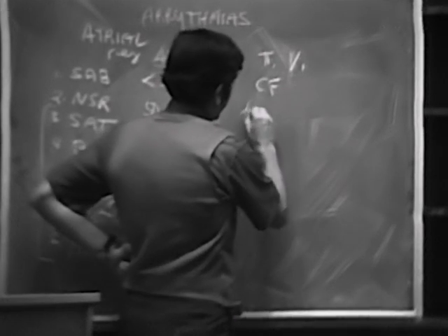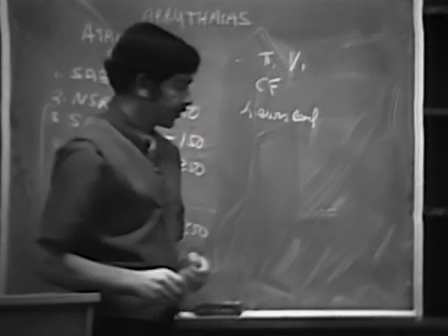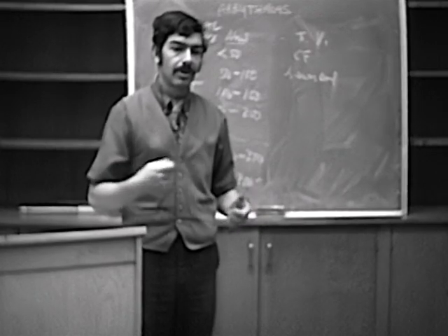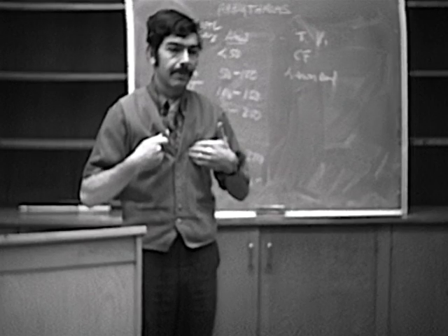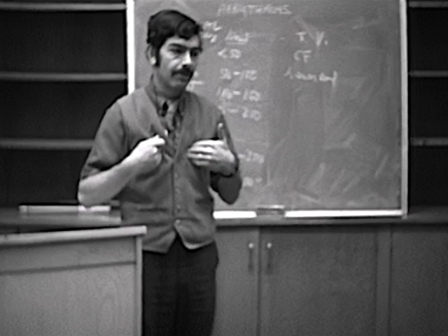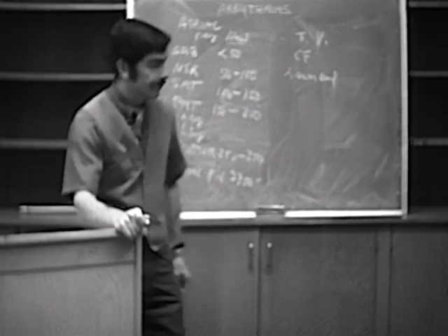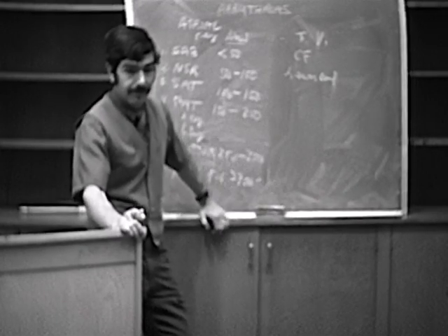Another lead that some people try is a Lewis lead. I haven't had too much luck with that, but some people recommend using the Lewis lead. What you do is you disconnect the right and left arms and you put a strap around the chest. And the plates that were in the right and left arms go in 2 positions underneath this strap. And you set your electrocardiogram onto lead 1, and you record the difference between these 2 electrodes on the chest. Right? Everyone understand how to do that? I haven't found it too useful, but you might. I haven't used it that often.